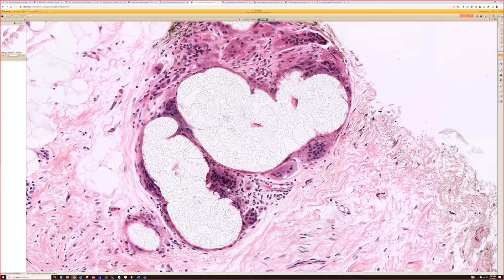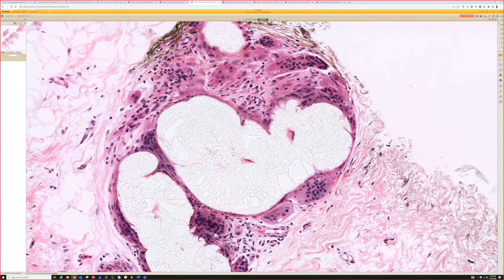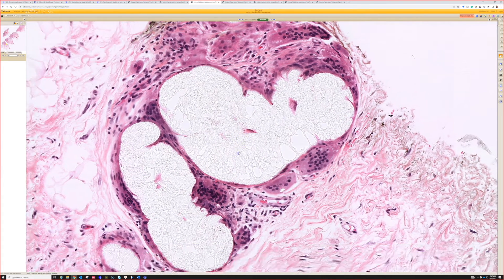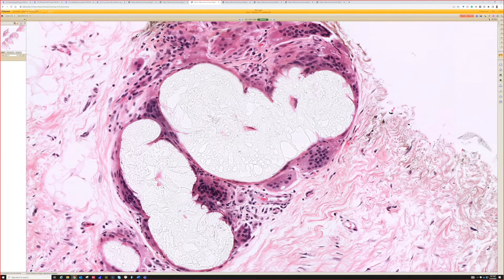Whenever I see something refractile and 3D with giant cells around it, I suspect it's foreign material. In this case, this is actually injected steroid — Kenalog or some other form of injected corticosteroid. You can usually see this in the middle of scar tissue, particularly in keloids when they've been injected with steroids and then eventually removed — you'll see little islands of this in the scar tissue.